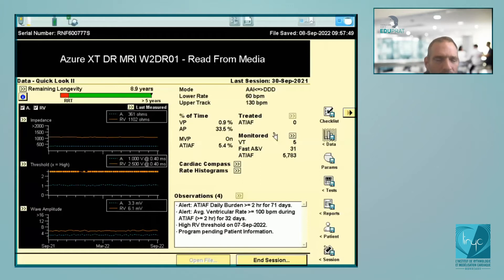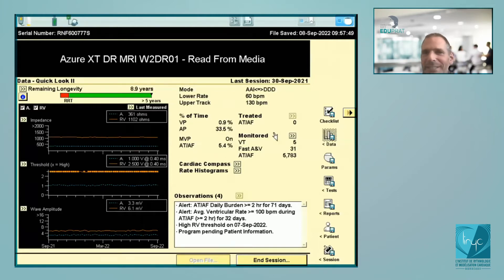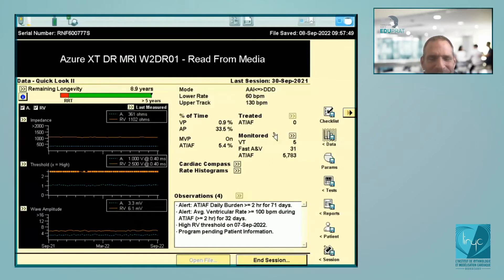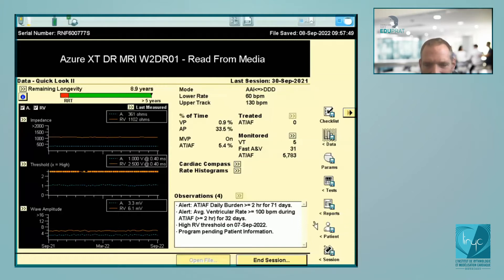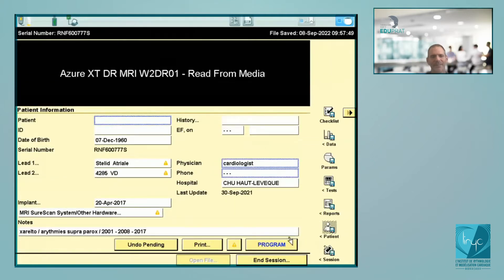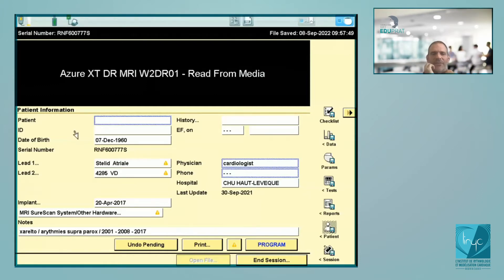This is the first screen of a dual chamber pacemaker — a patient implanted in Bordeaux — and we're going to see the different steps of interrogation. When I arrive for interrogation of a pacemaker, the first thing I do is click on what's written as 'Patients,' then 'Patient Information.' I think it's always interesting to know what you're talking about and which kind of patient you will be interrogating.